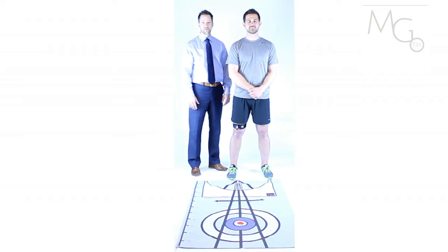Hi, I'm Eric Dinkins with Motion Guidance, and today we're going to discuss ACL rehab using the Motion Guidance device. In this example, we have the small strap placed approximately one inch above the kneecap. The flat mount and the laser are then slid into the sleeve on the strap. The patient can then turn the laser on and place it approximately in front of the big toe.